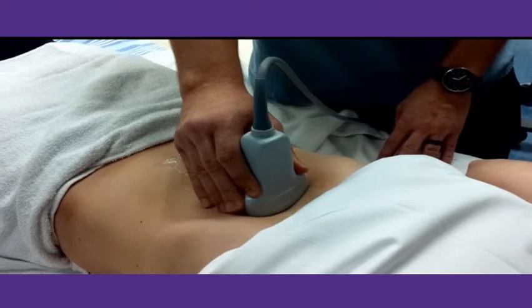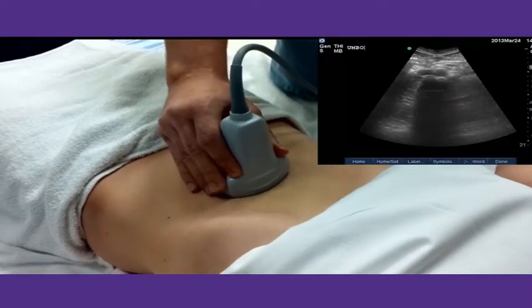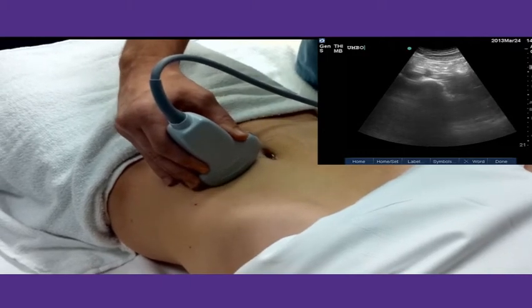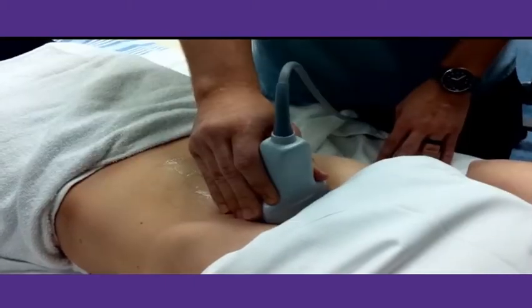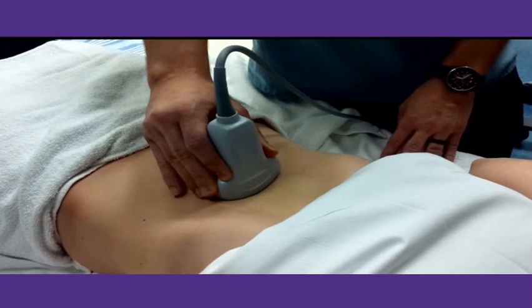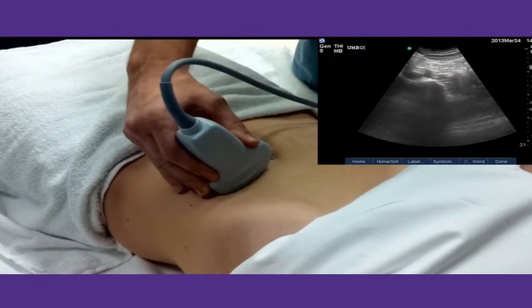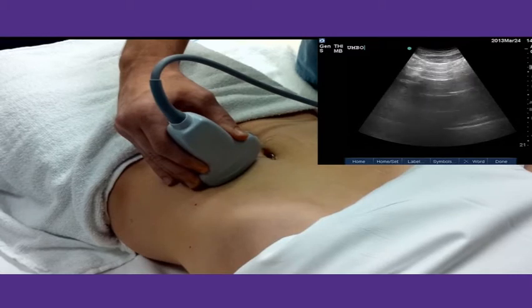The second option is to orient your probe in such a way that you get a glimpse under the umbilicus from its lateral aspect, as is shown here in this clip. It is important to visualize your area of interest prior to performing this maneuver and keep it in view at all times. This ensures that you are always following the right vessel as you change your plane of scanning.